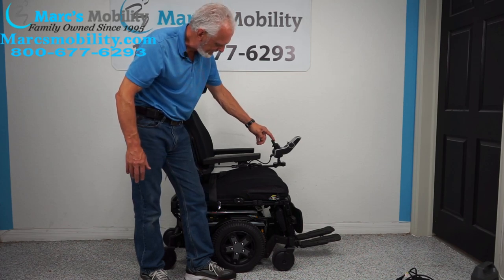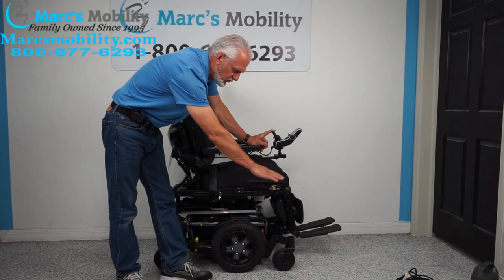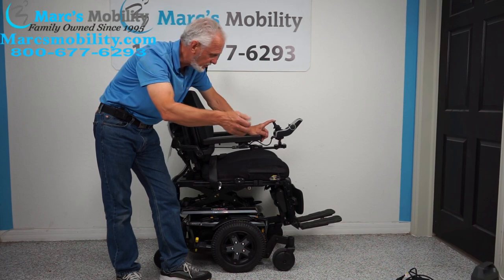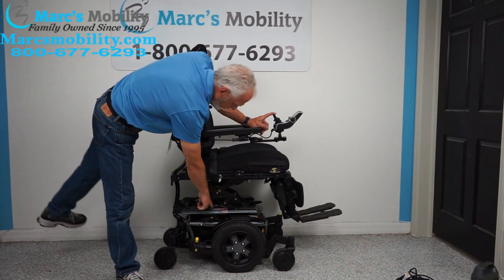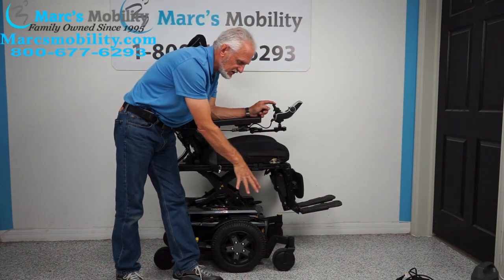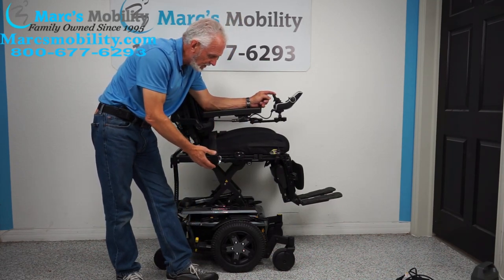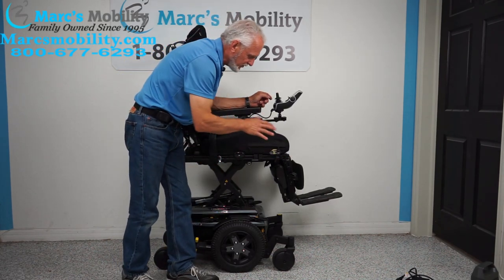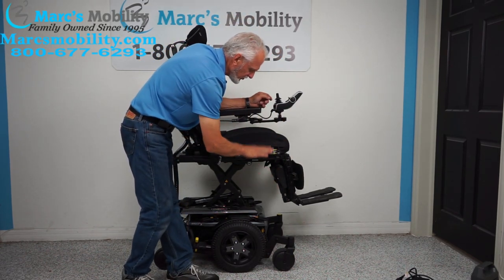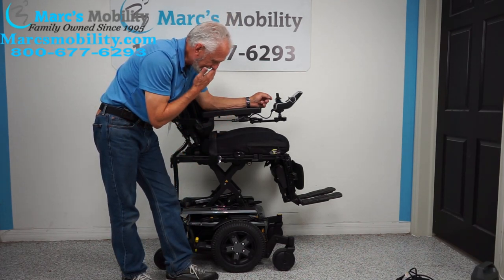Now you can use the joystick back and forth — up and down instead of sideways. If I go back, you can see the seat starting to go up. You start at roughly 22 inches and by the time you're all the way up, 12 inches of lift, you'll be at 34 inches — eye level. You can talk to someone eye level, do your dishes looking down, grab stuff on the second shelf. The seat lift also helps you get out: lift the seat up, put the footplate up, and you can slide out.